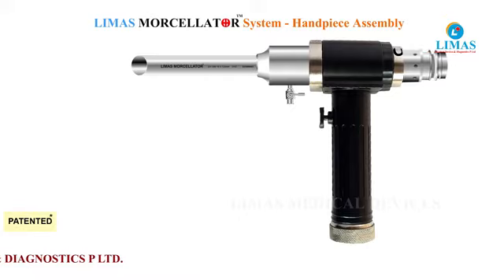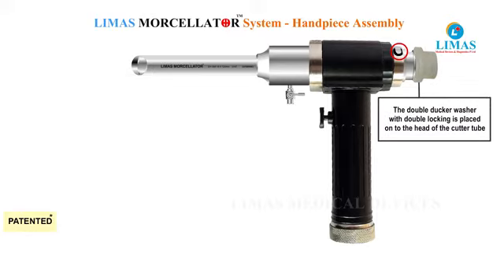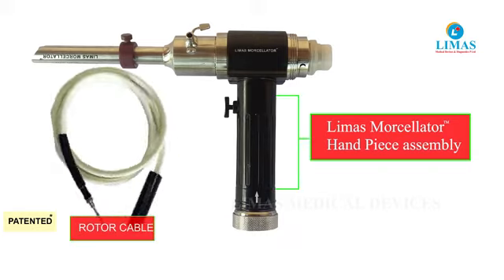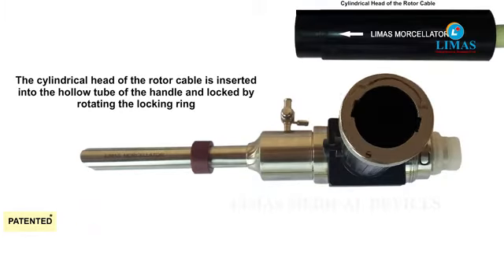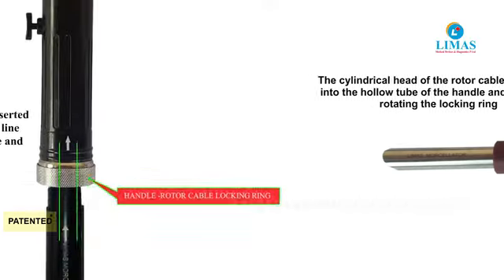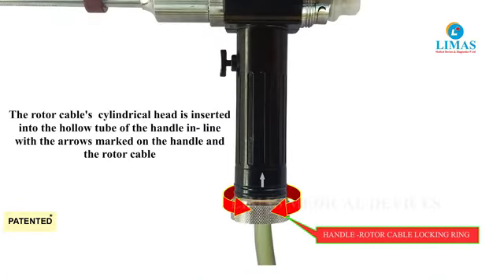Once the cutter blade is fully inserted and locked at the secondary pinhole slot, it exposes the cutting edge for morcellation. The double docker washer is placed onto the head of the cutter blade. The cylindrical head of the Limas Morcellator rotor cable is inserted into the tubular area of the handle, as indicated on the rotor cable head, and locked with the locking ring of the handle. The arrows are matched while inserting to ensure it is properly locked.